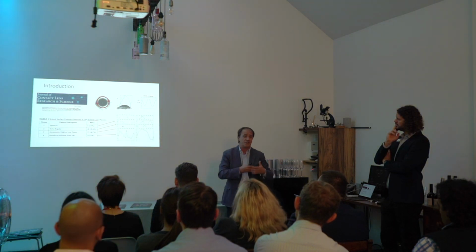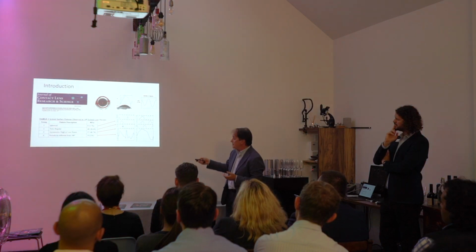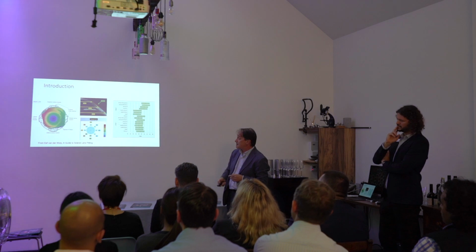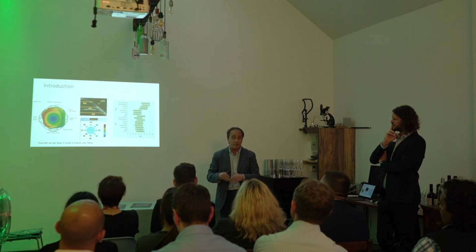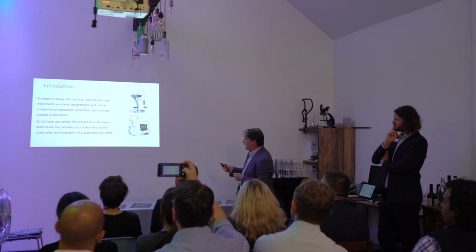So it's not like evaluating a simple astigmatism, because there are different toric behaviors, and we also have different behavior in the depth of the anterior segment. And so, in which way can I fit a scleral lens without information on the peripheral part of the eye?